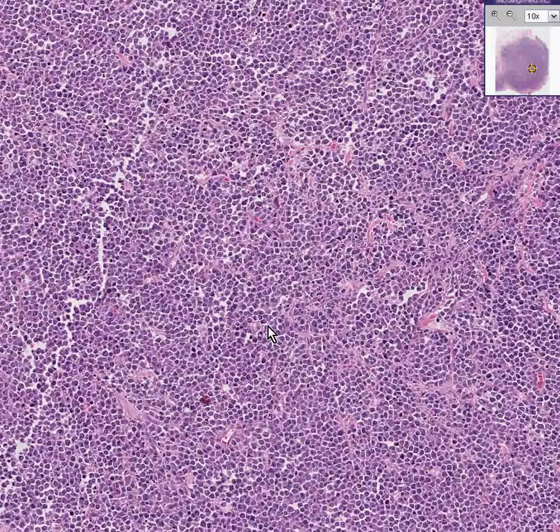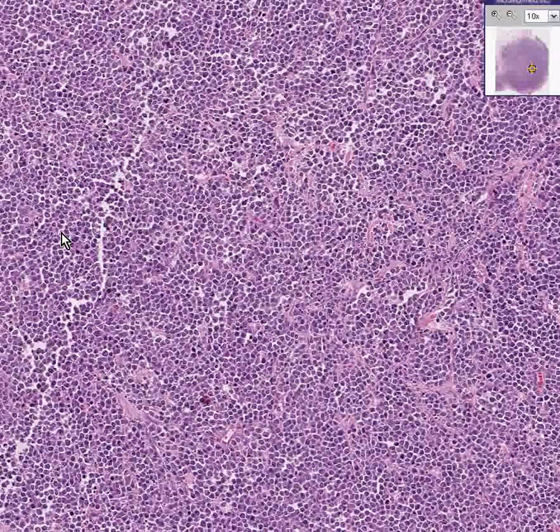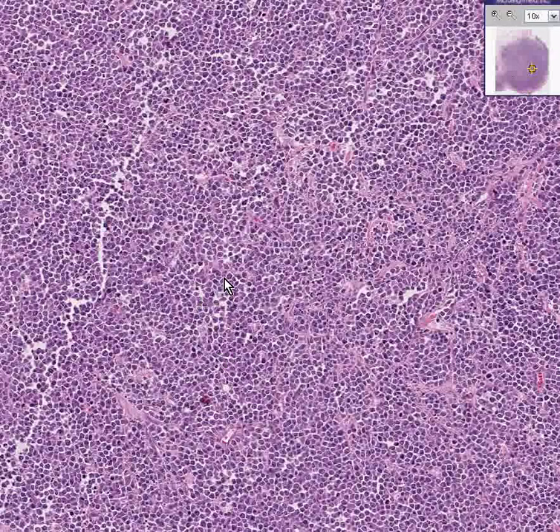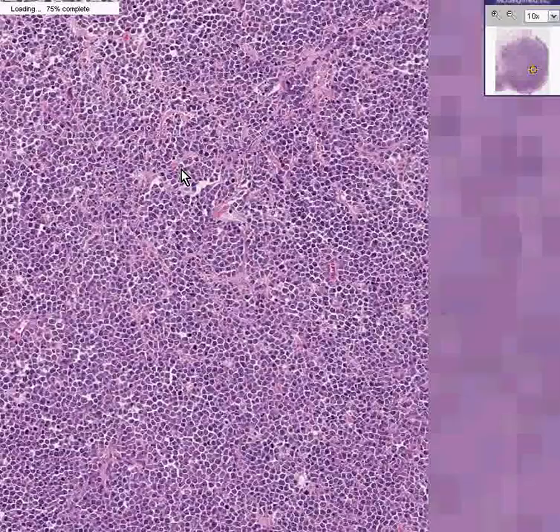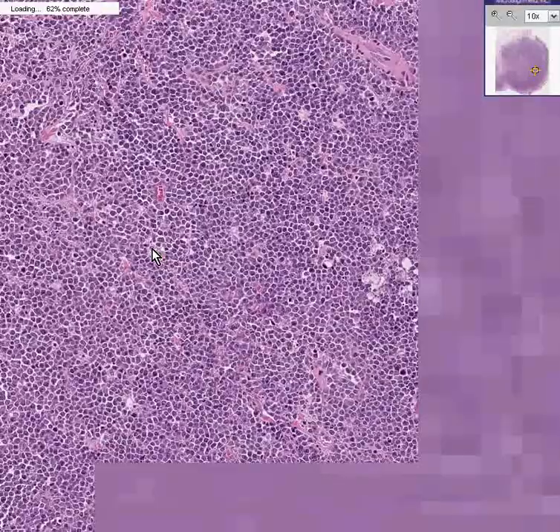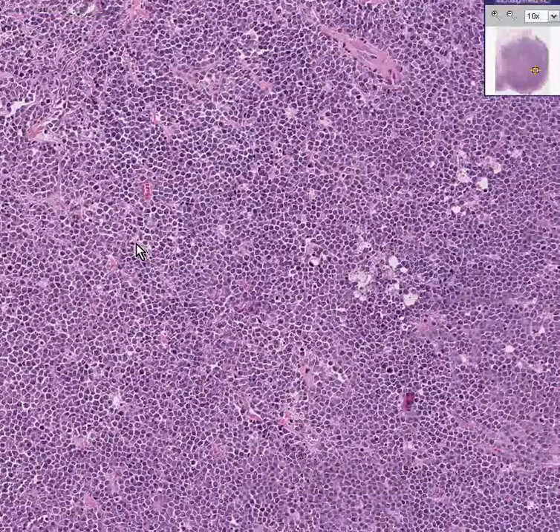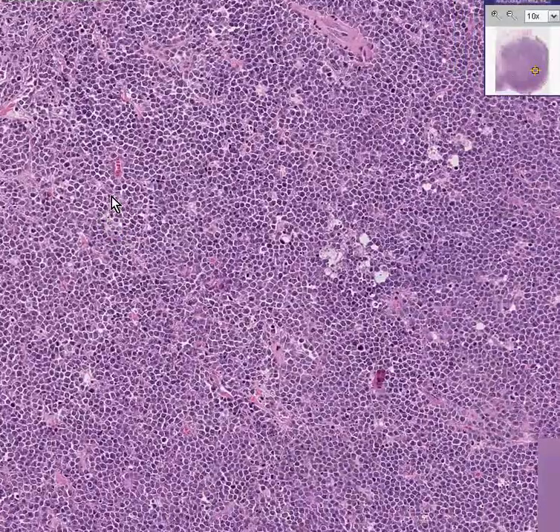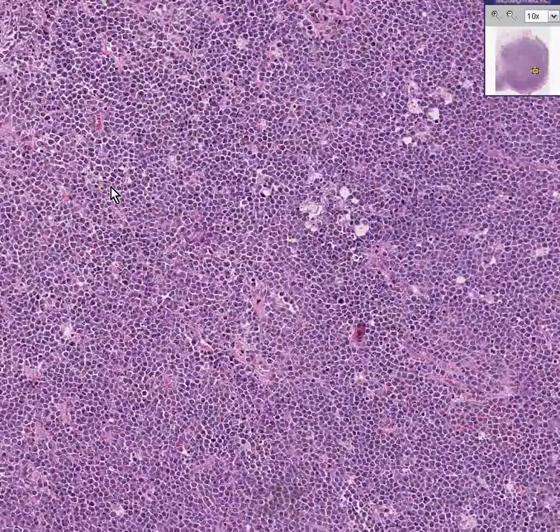If you look at it at medium power like you see here, you will see whiter areas — there, there, there — that almost look like stars in the sky. Perhaps this is more apparent in an area like this where you see clear areas scattered throughout.